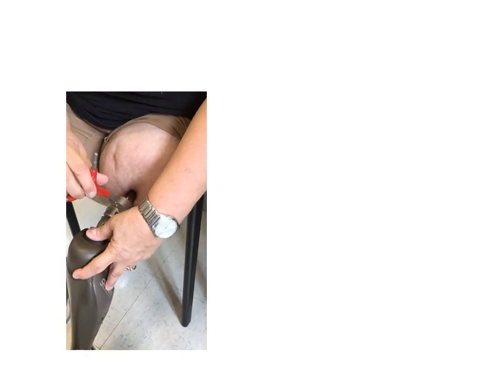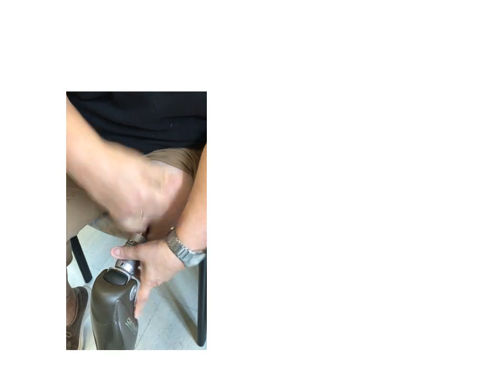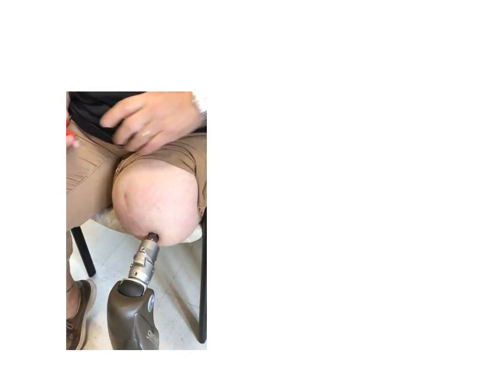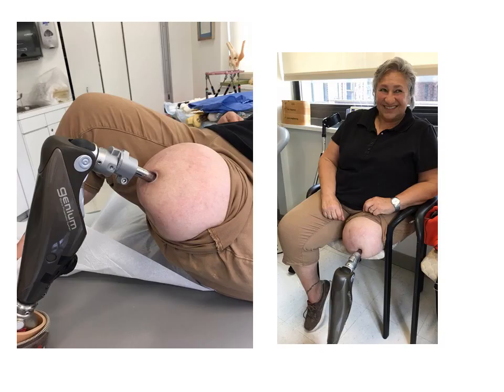Here you can see the abutment that is sticking out of the stoma. Donning of the prosthesis is a relatively simple procedure with applying it and a simple tightening of the main screw. This is what it looks like when she is sitting, and here Gail is lying down with the knee flexed and then sitting with the knee flexed.